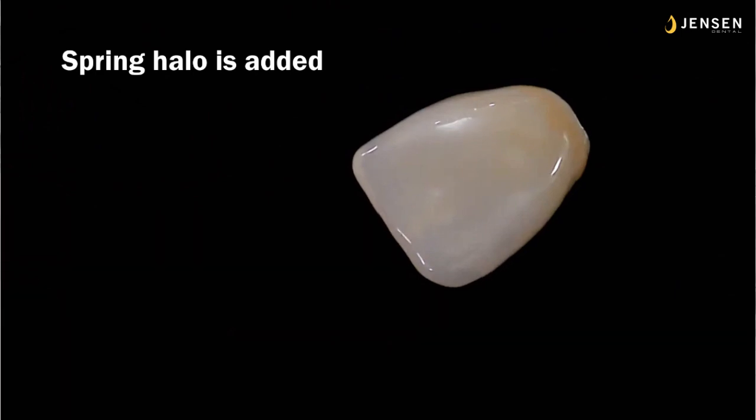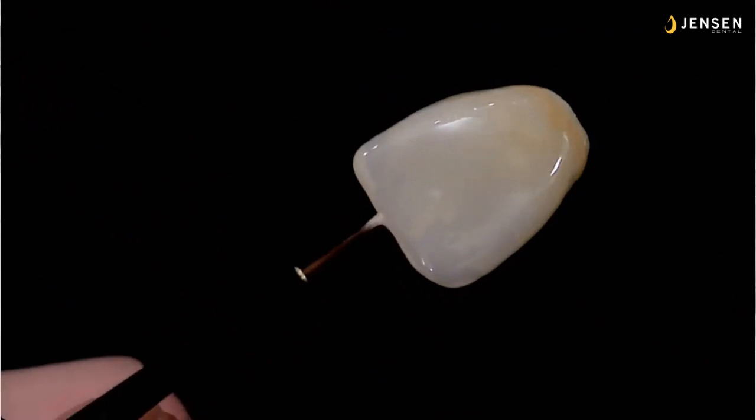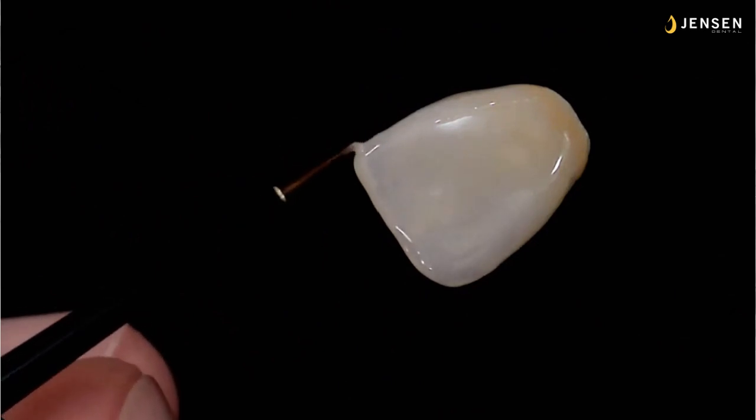And now I'll add some spring halo. And I keep this just a little bit thicker, and then it wants to string like a hot glue gun, where you can just keep it right on that incisal edge. And again, because you have the in-sync paste glaze, it'll stay where you put it.